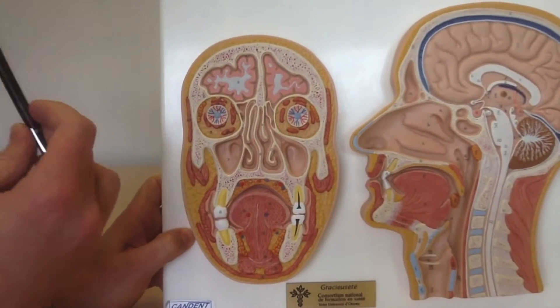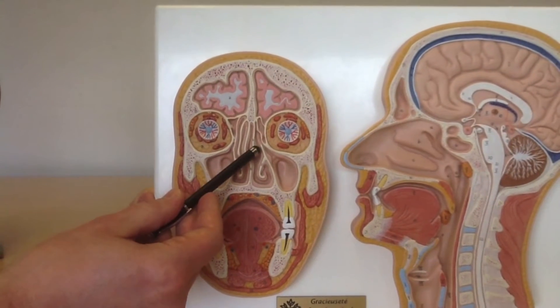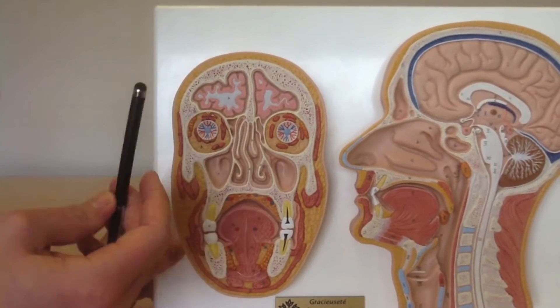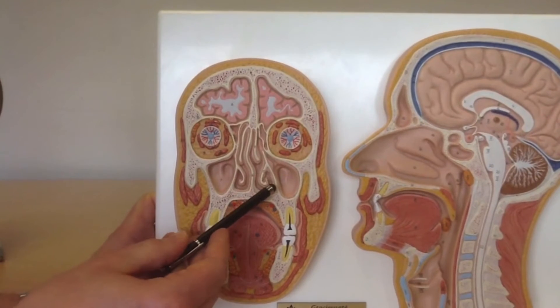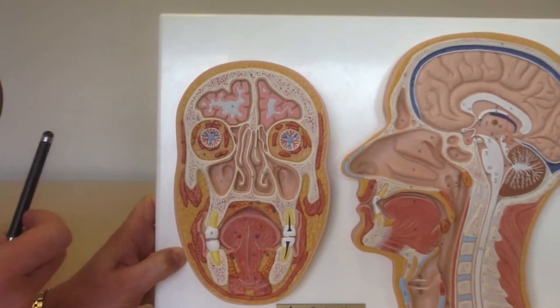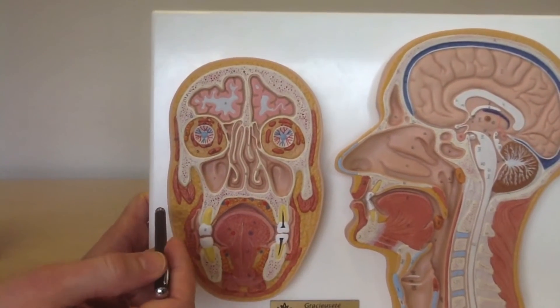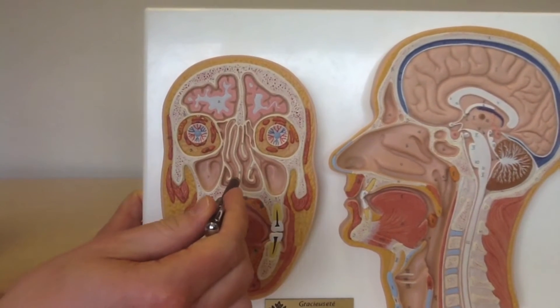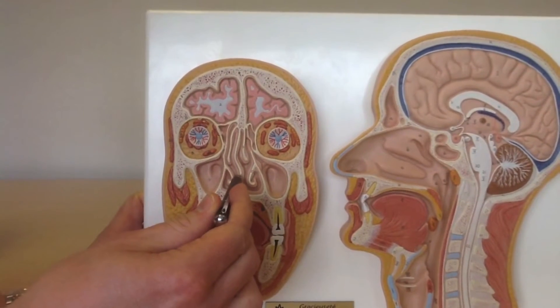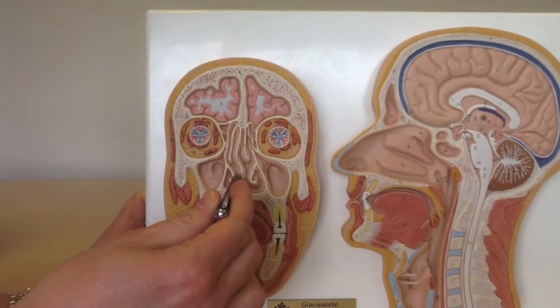In the coronal model, again we can see the middle turbinate here and here on opposite sides, and the inferior turbinate located here and here. When inserting the catheter to deliver the flow seal product to treat posterior epistaxis, you would insert the catheter into the nasal cavity roughly in this area.